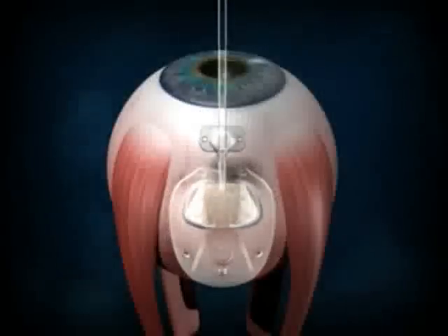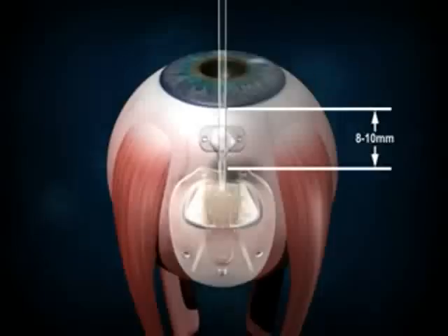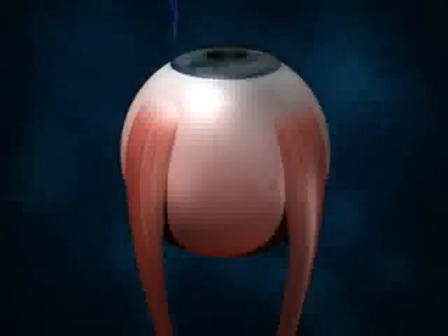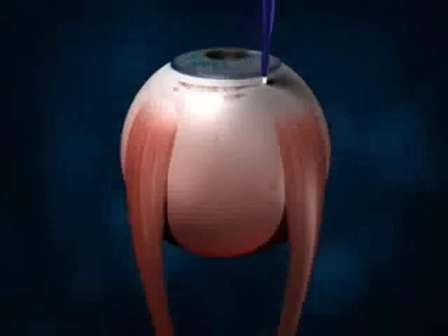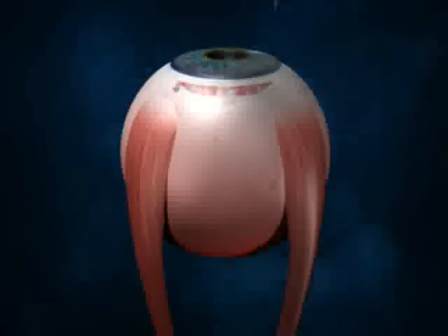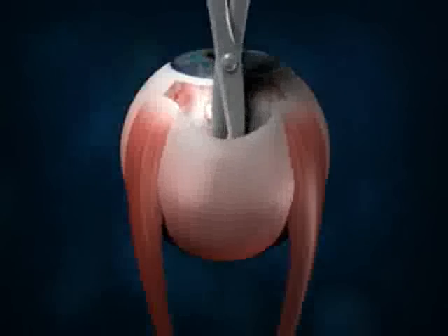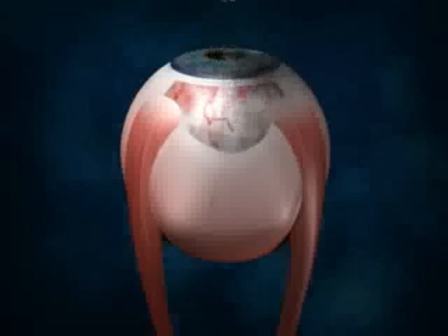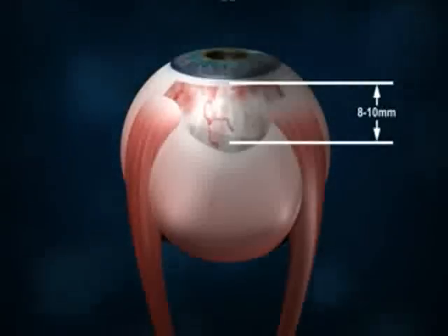The Ahmed glaucoma valve is placed in between the sclera and Tenon's capsule, about 8 to 10 millimeters away from the limbus. Take a sharp scalpel and make either a limbal or fornix-based incision. Using blunt Westcott scissors, expand this incision, making a deep pocket between the rectus muscles. The pocket should be deep enough for the valve to slide 8 to 10 millimeters away from the limbus.